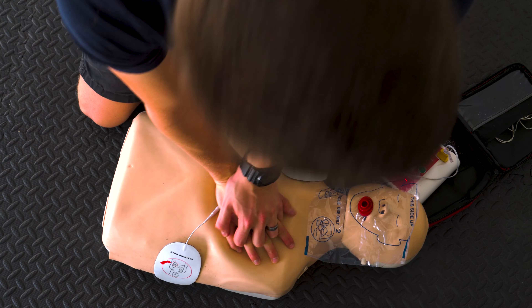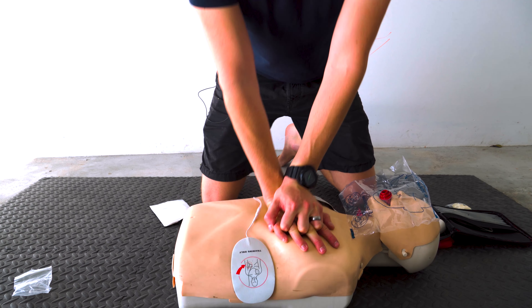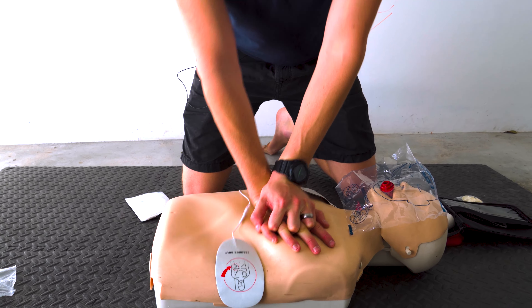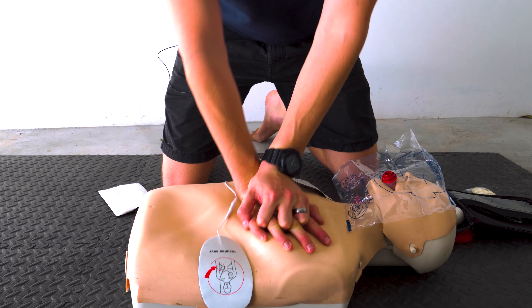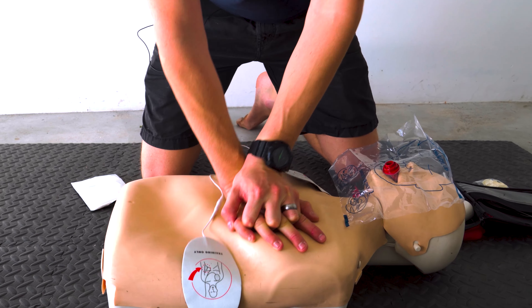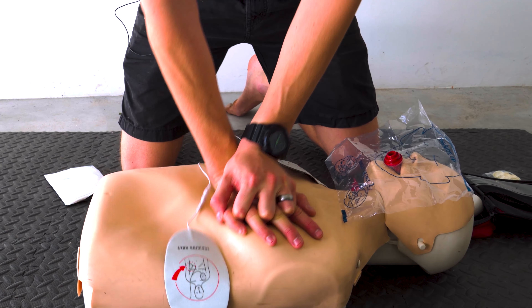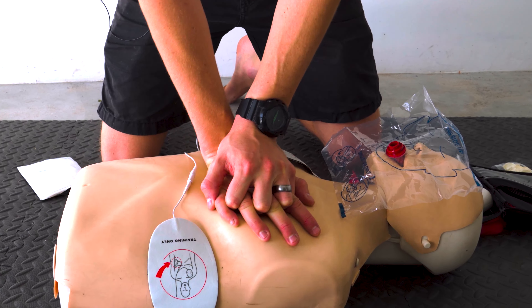Resuming CPR immediately after shock delivery — AED prompts 'Start CPR.' Performing compressions, counting from 5 through to 30. OK.